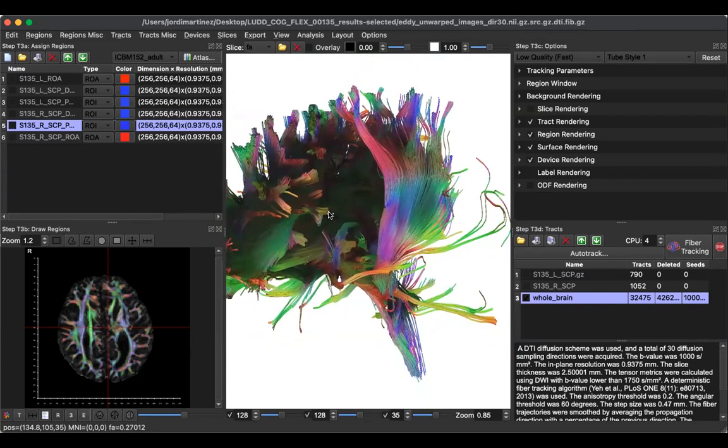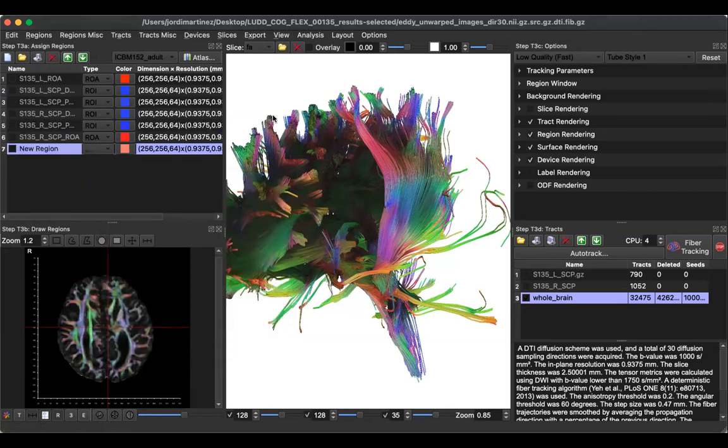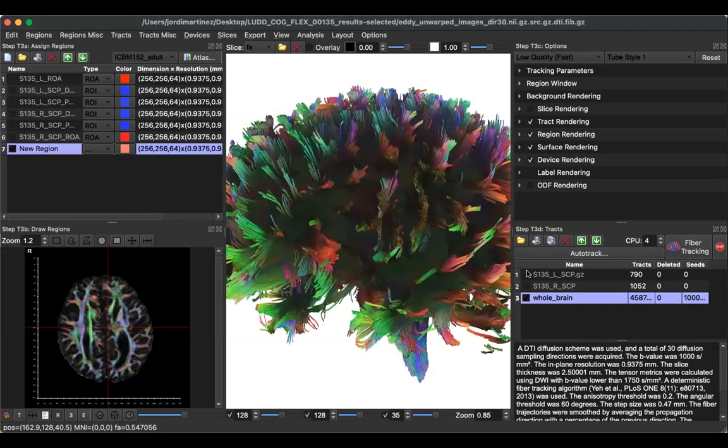Okay, wait, go back to this corner. You should see the cingulum here, it's green, right? This one right here, yeah. That's just the whole FA map, right? Let me undo everything real quick. I forget, the anterior-posterior fibers are green, right? Yes, green is anterior to posterior. So that must be the same. But there's nothing on the other side?